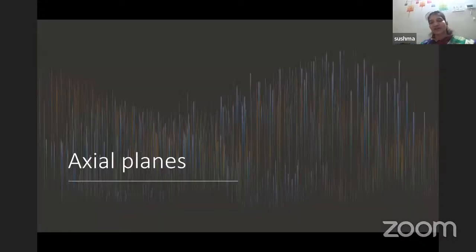So first we'll start with the basic planes of the fetal brain. Axial planes are the most common planes that are taken. As we all know, the fetal biparietal diameter is the most common measurement that we take, on the transthalamic plane. Both BPD and HC are taken on the transthalamic plane, and that is an axial plane.